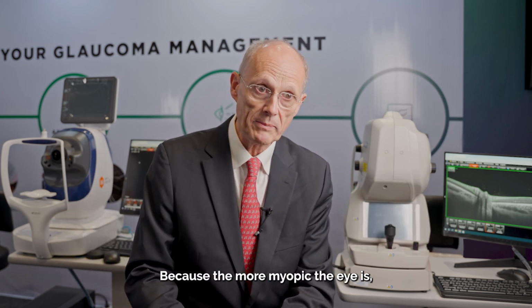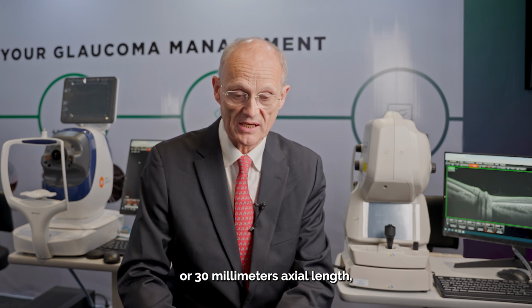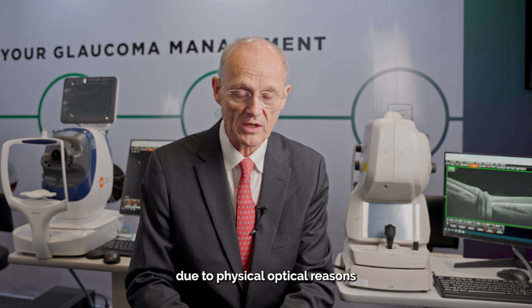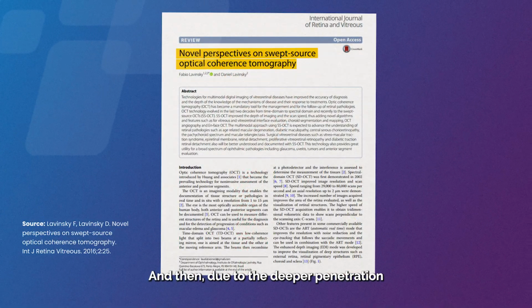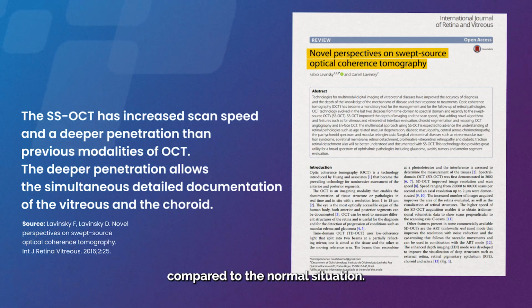Because the more myopic the eye is, minus 20 diopters or 30 millimeters axial length, the more difficult it gets, due to physical optical reasons, for imaging devices to really delineate the structures. And there, due to the deeper penetration, swept source may have some advantages compared to the normal situation.